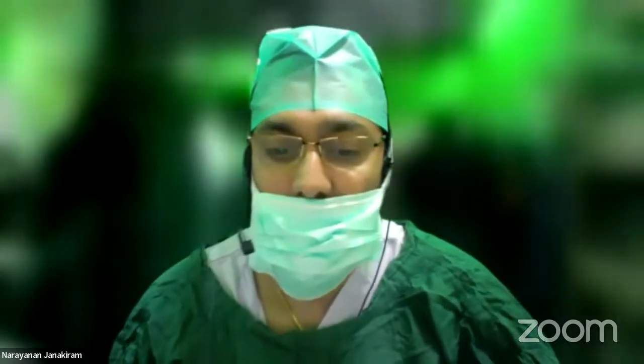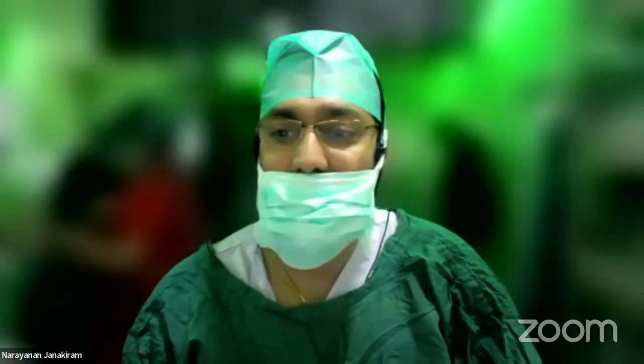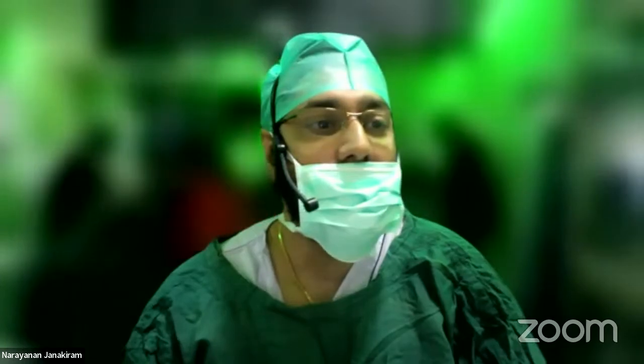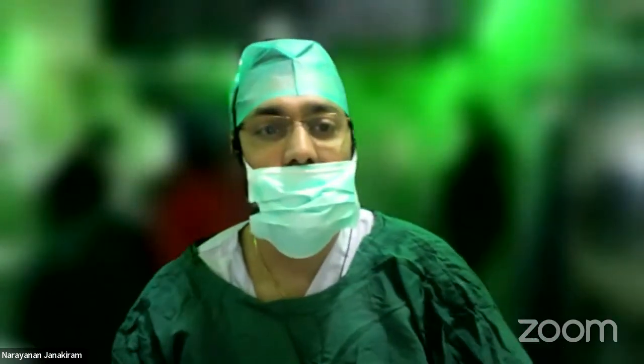Yes, sir. Did you see the surgery? Yes, sir. Very nice, sir. Do you have any comments? You have used this coagulator as a dissector. Yes, it was a very nice idea, sir. And another thing is the adenoid, don't immediately jump and do some cauterization and coblation. Don't do that. If you do that, you're unnecessarily giving more energy and also producing more pain post-op.